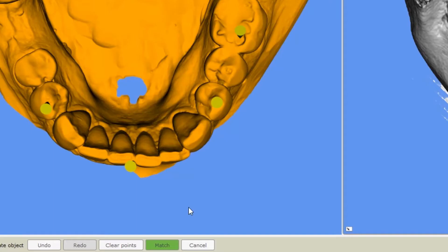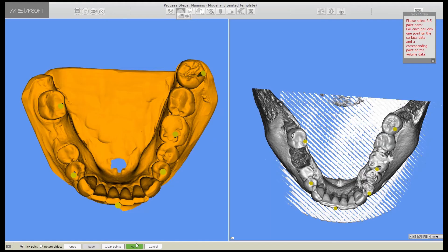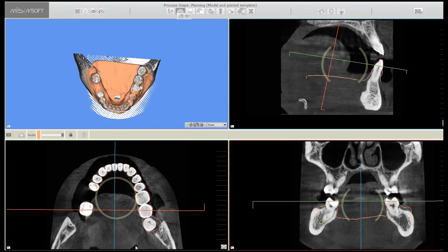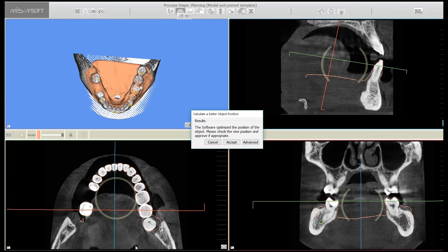You can now see that a green match indication is showing on the bottom of the screen. This means that we have enough points for the system to continue matching automatically. Now we'll click on the green match button and the system will do the matching by itself. After these steps, you will see a dialog asking you to decide whether or not to accept the position automation made automatically by the software. You can choose to either cancel the calculation, accept it, or advance to change the threshold and recalculate. We're going to select accept.